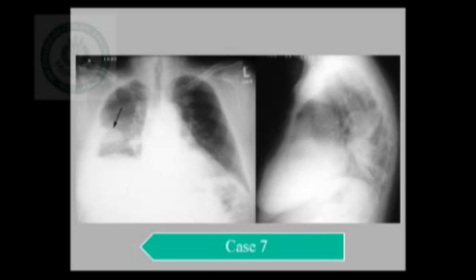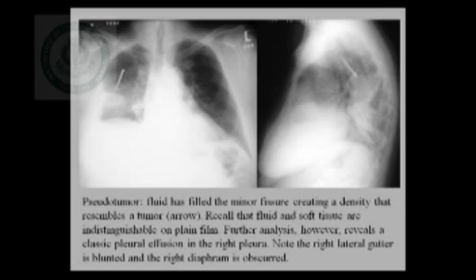Now this case shows an opacity in the right mid zone, and if you carefully look, the right costophrenic angle is also obliterated. Now is it a tumor?